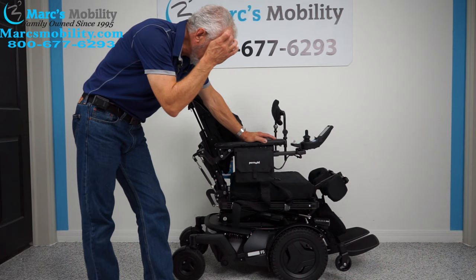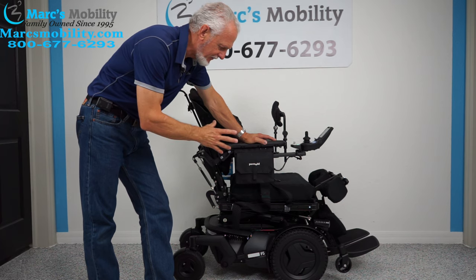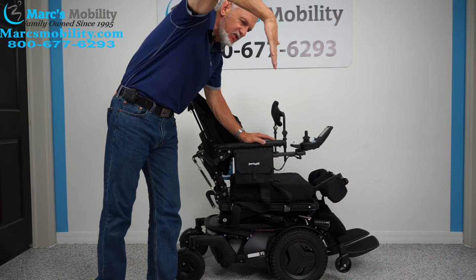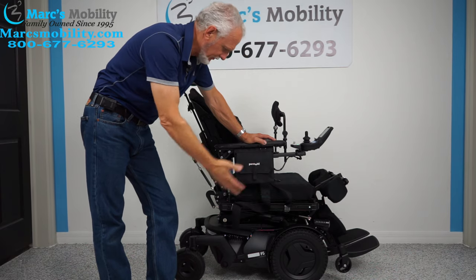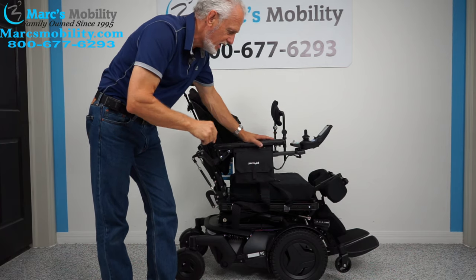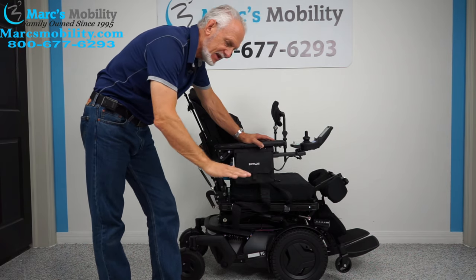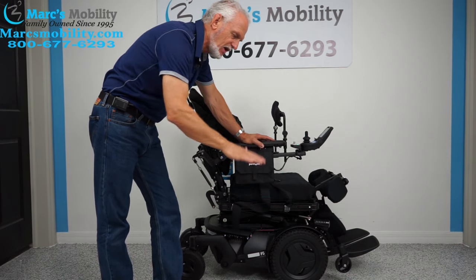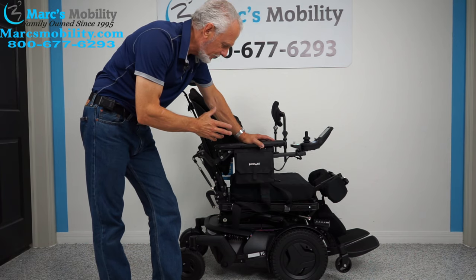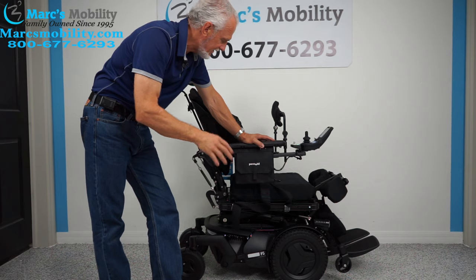We have a pretty intense power chair here — this is the Permobil F5 VS, for vertical standing. This chair will stand a person from a sitting position to a standing position. It has only two miles on it, so it's literally brand new — the tires aren't even dirty. It has seven electrical functions: the 14-inch seat lift, electric tilt, electric recline, electric feet, anterior tilt, feet up and down, and the standing feature.